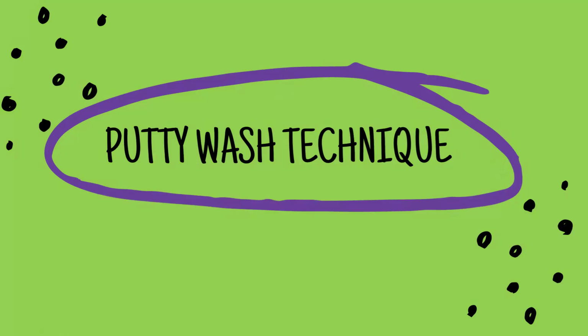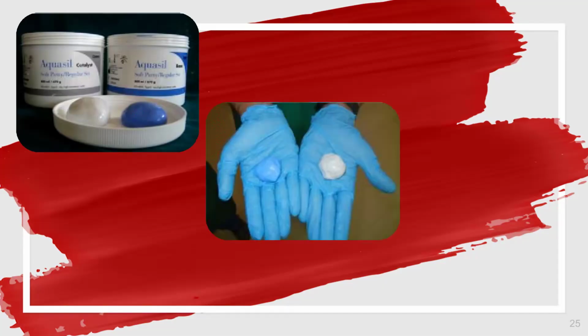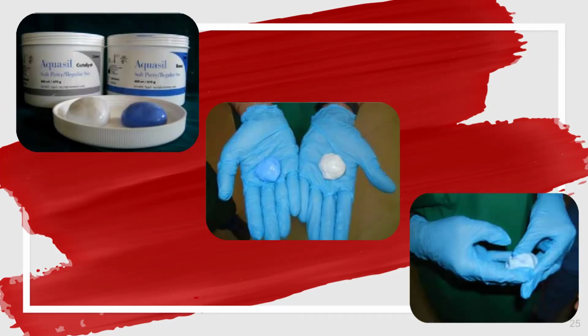Moving on, we'll go to putty wash technique. Here, putty material is used for the initial impression, followed by a wash material for the fine details. We'll take equal proportions of the base paste and the catalyst paste in putty consistency. Mix them until you get a uniform color. We'll mix the impression, and at the same time, we'll dispense equal proportions of the light body base paste and catalyst paste, and you apply it as a wash over the initial putty impression.